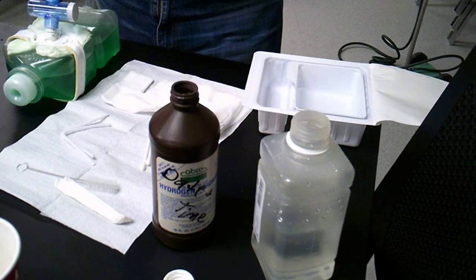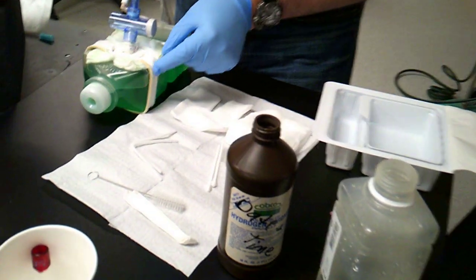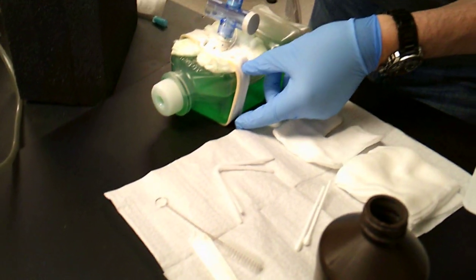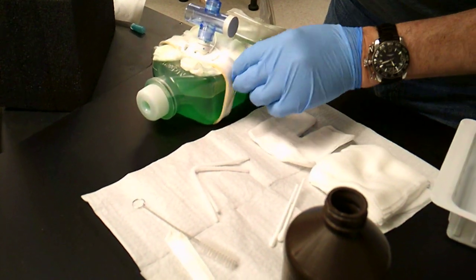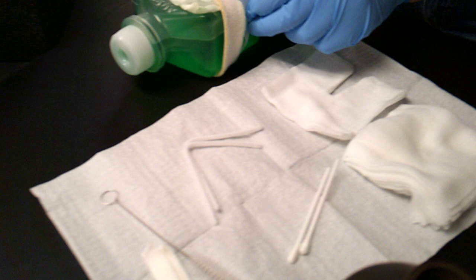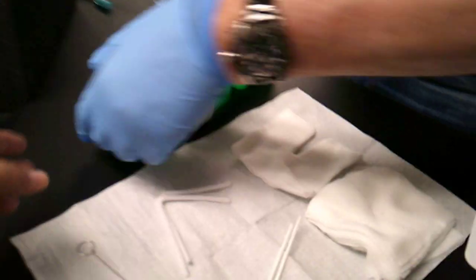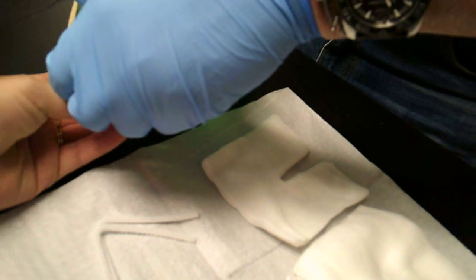So, I'm going to go ahead then and remove the old dressing. Make sure when you're, oh, these are the trach ties. It's there. The back, yeah. There we go.